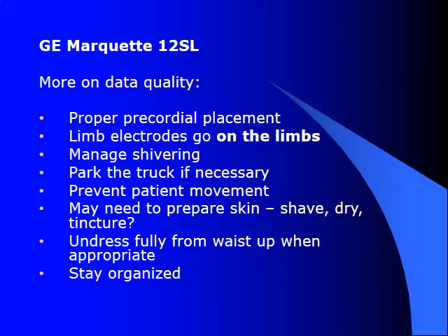So proper limb lead placement and proper precordial placement is a very good start to getting good data quality. We need to make sure, like I've mentioned before, that the limb leads are going on the limbs. Manage shivering as much as we can. Park the truck if it's necessary. Anymore, you can get decent data quality while you're moving if you're on a highway or something, but whenever you're going through town, it is pretty difficult to get good data quality. Advise the patient not to move.